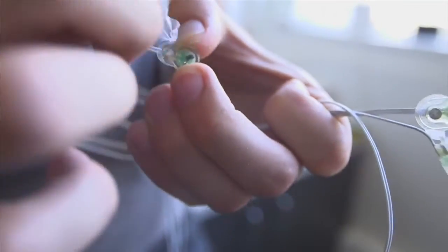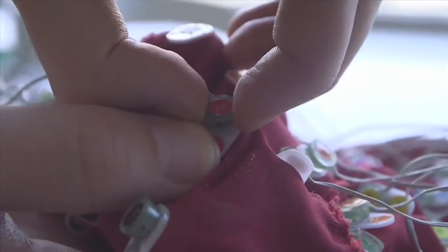When removing the adhesive rings from the electrodes, again, make sure you hold onto the head of the electrode, not the cable. The same applies when removing the electrodes from the cap. Never pull on the cable.